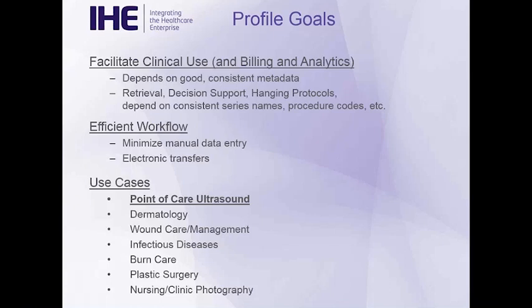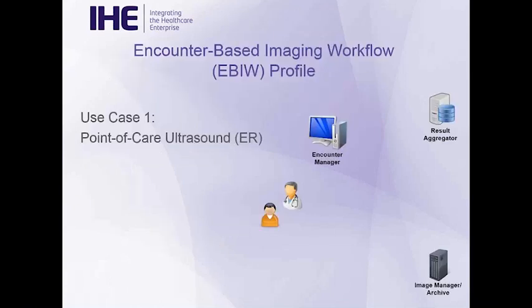Now, there are a huge number of use cases. This was all the et ceteras in that list. Because it was a pretty big chunk to bite off in one bite, we decided to take it step by step. And so this first profile is focused on point-of-care ultrasound. There are absolutely a ton of uses in other areas. And our intention in this coming year is to submit a proposal to do the second half of the profile, if you will, or the second flavor of the profile, which is to address digital photography and the use of smartphones and tablets. But to get our feet wet, the first profile is on point-of-care ultrasound. And so you can imagine being in an ER, for example, and the physician has a patient there, and he thinks, I'd like to take a look at this, and he grabs the ER ultrasound cart and rolls that over.